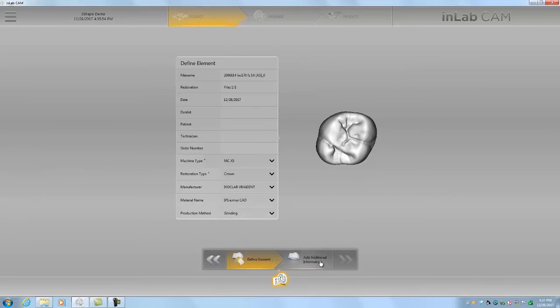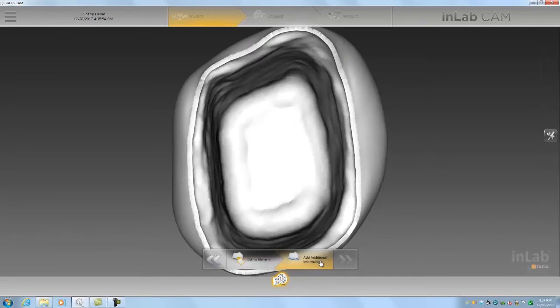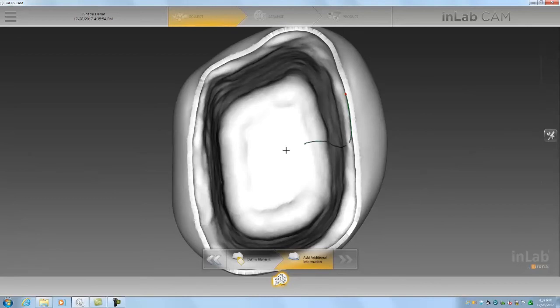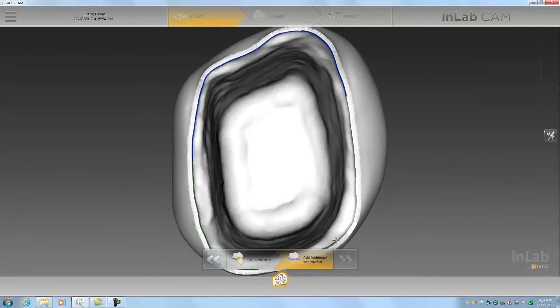Additional information, we'll go and select our margin line. Basically we just need to click three points here and then it should link back up. Double click to finish.